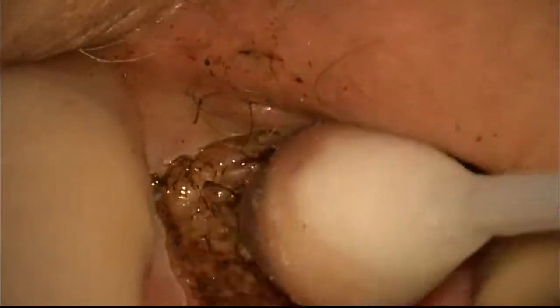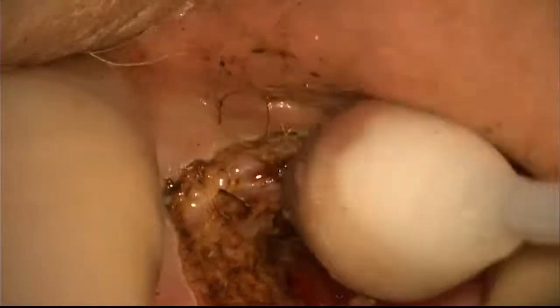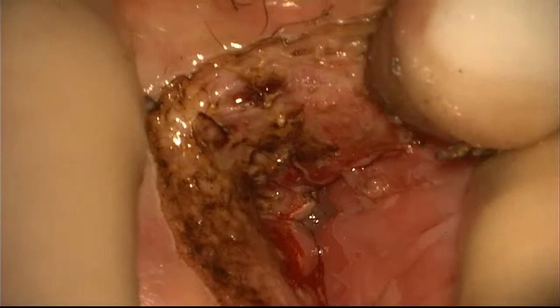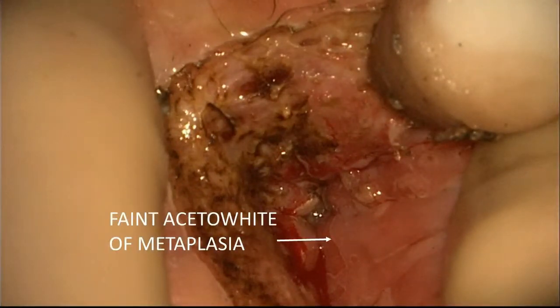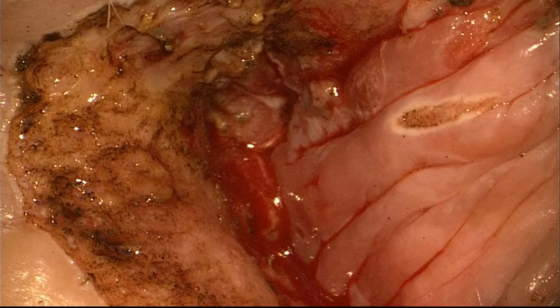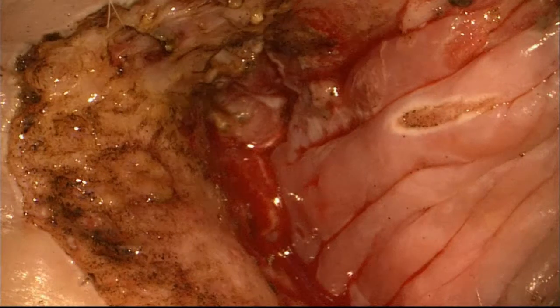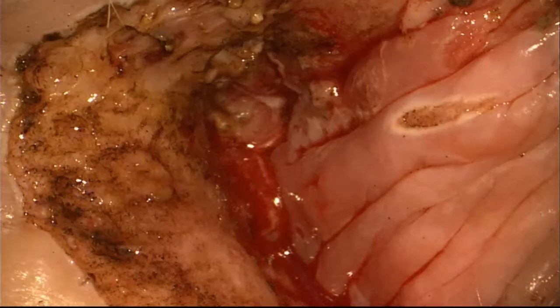I'm passing the laser once more over the thicker hyperkeratotic area, which might have some hair follicles. Now I can see the faint acetyl white of the other side — I think it is normal and I will not laser that area.